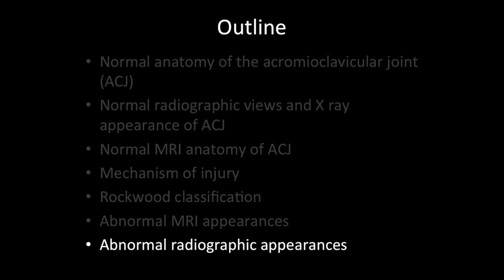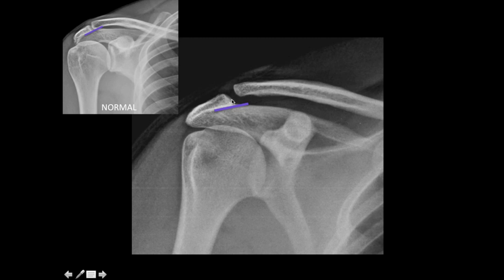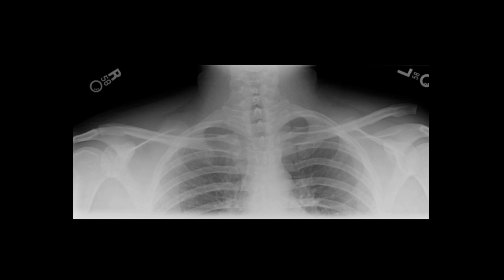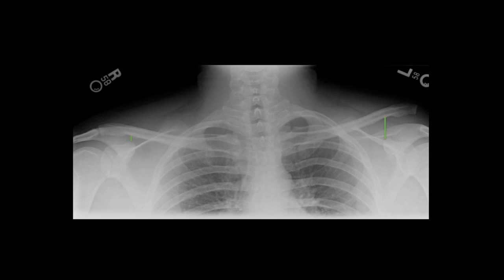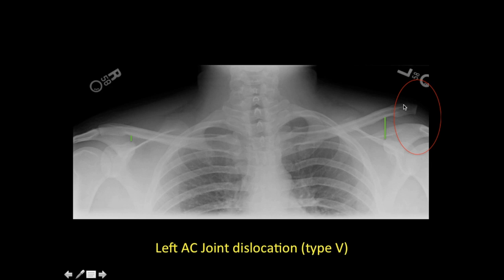Looking at abnormal radiographic appearances: in one patient the inferior borders are not aligned but there is no complete dislocation — this is AC joint subluxation, which can occur in Type 2. In another patient, the CC distance is more than twice the normal with an obvious AC joint dislocation. Since the CC distance is more than twice normal and the clavicle has dislocated superiorly, this is Type 5 AC joint injury.